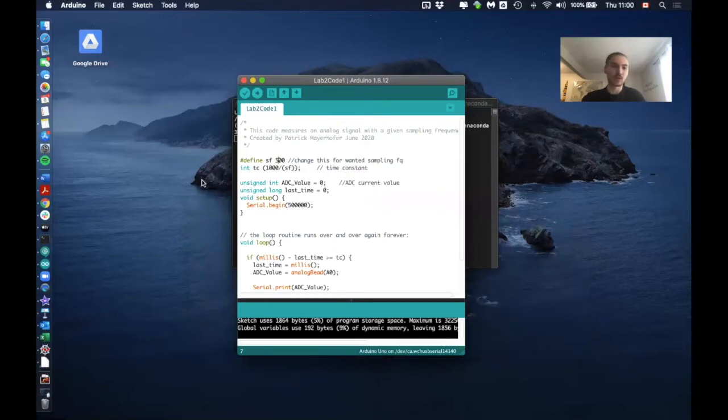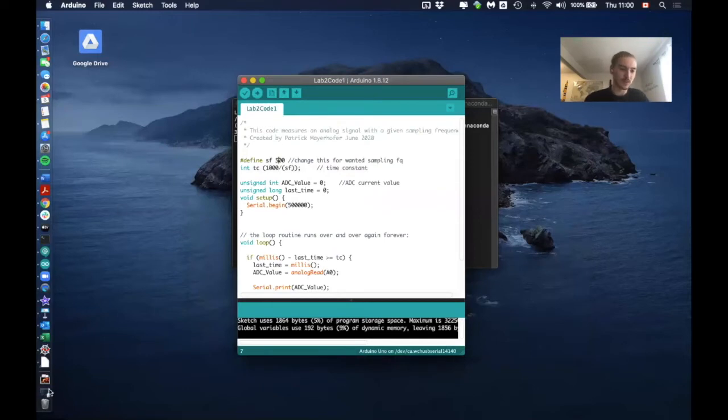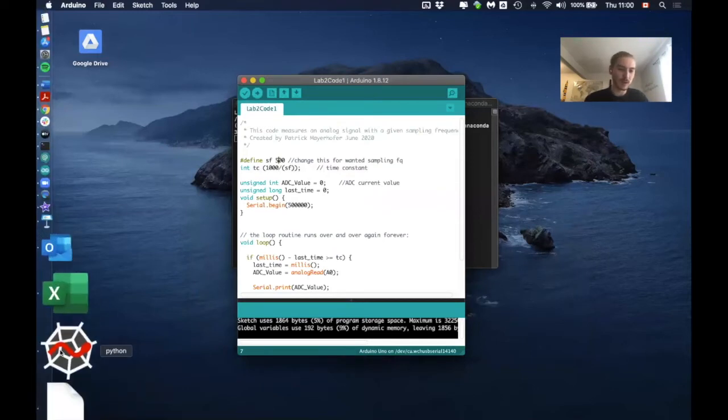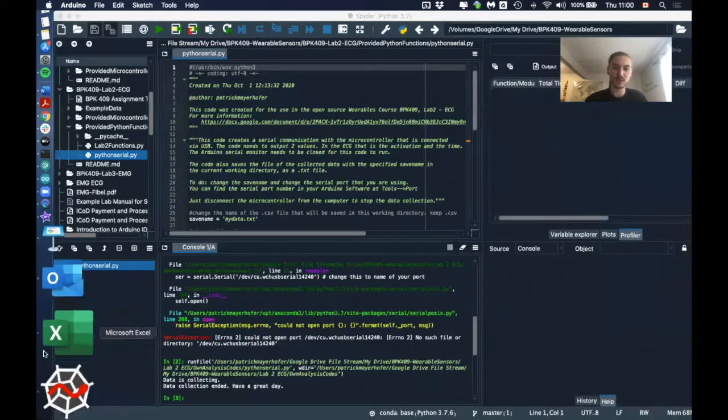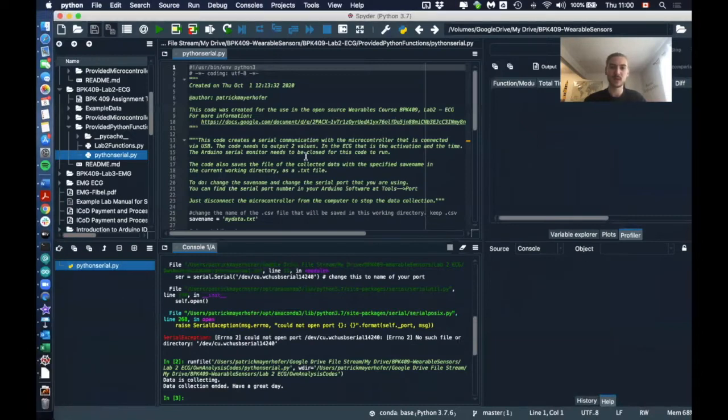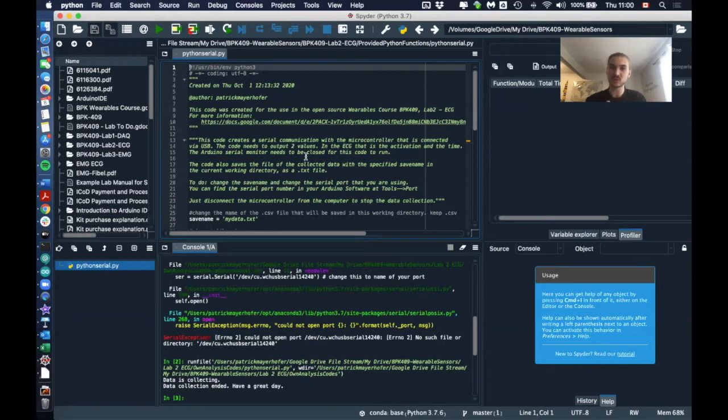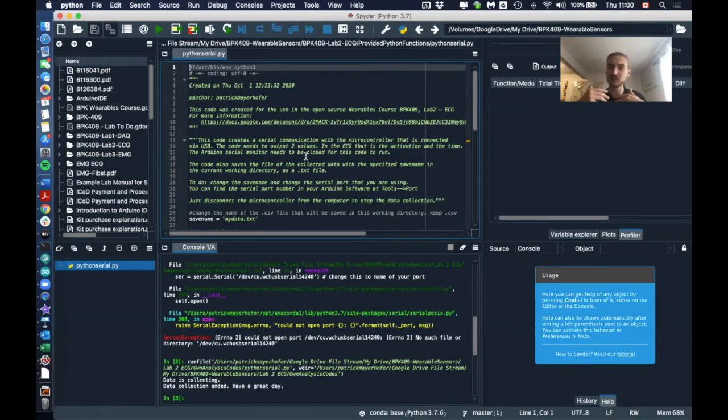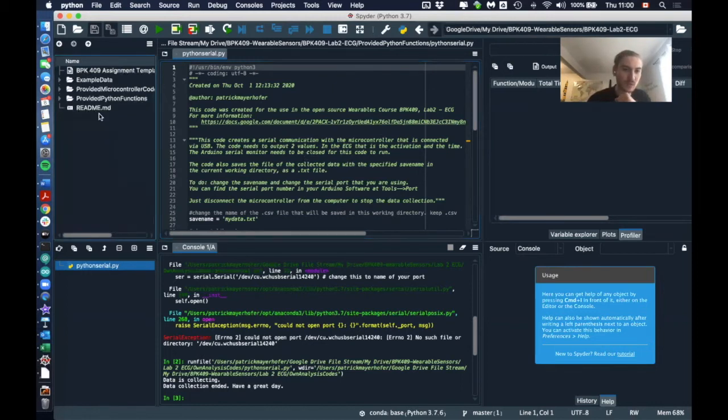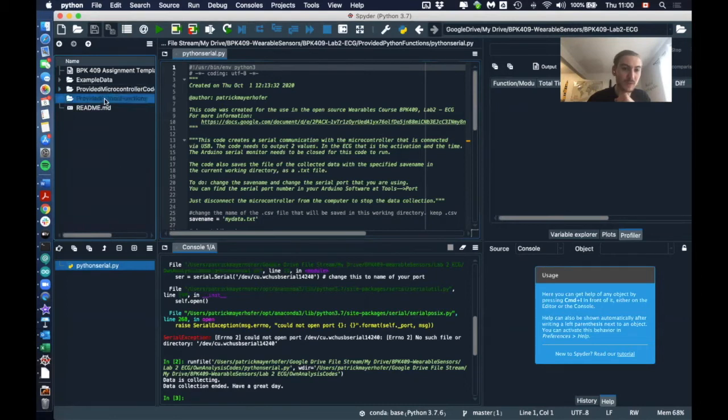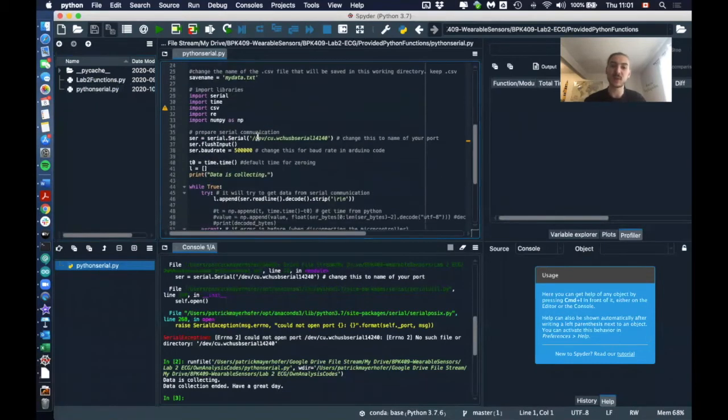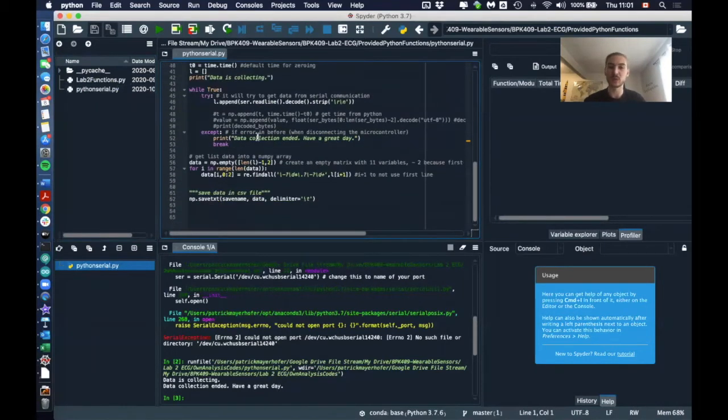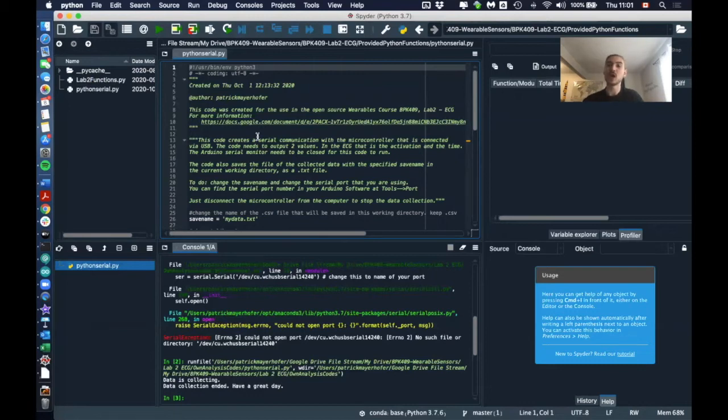Let's have a look at this now. So if I open my Python here, then if you download the new and updated Lab 2 GitHub repository, you will actually find in the provided Python functions—I think that's what it's called—let me see here, BPK2G, provided Python functions. You will find this new code that's called Python Serial, and this Python Serial will be the code that you can use to actually collect the data from the Arduino.